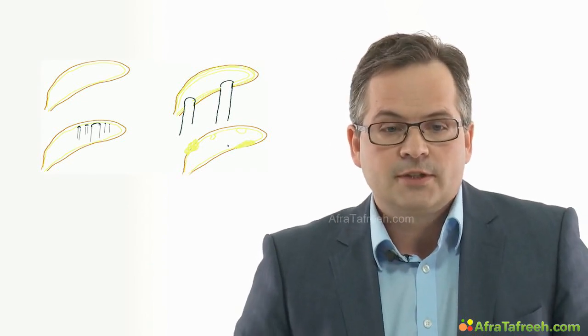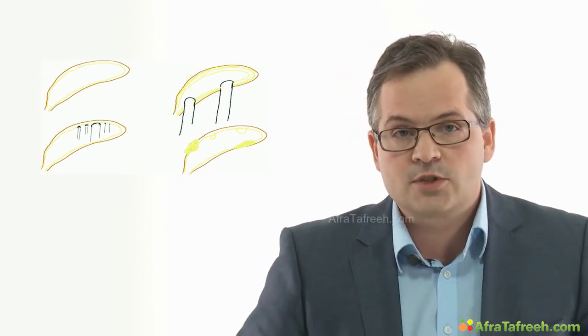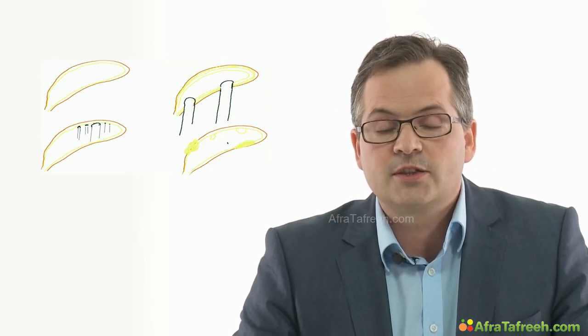Tumors are attached to the wall of the gallbladder and will not change their position when we change the position of the patient. So we can distinguish between stones and tumors.